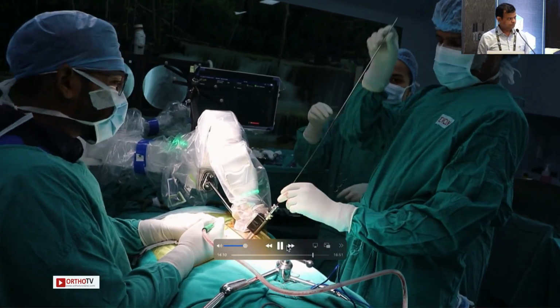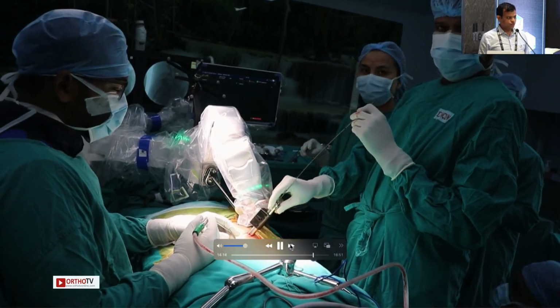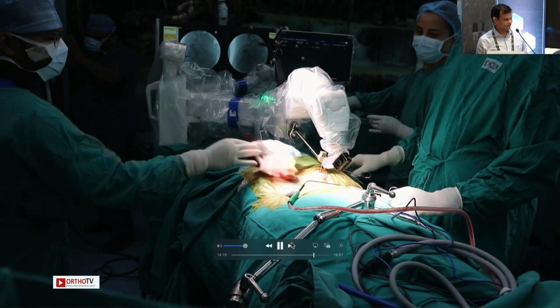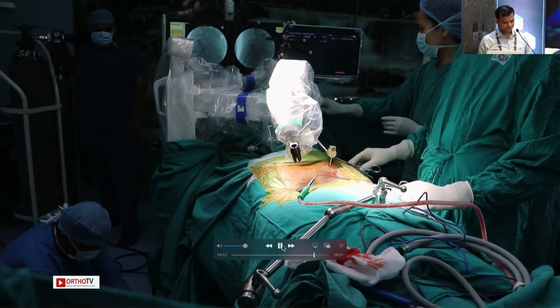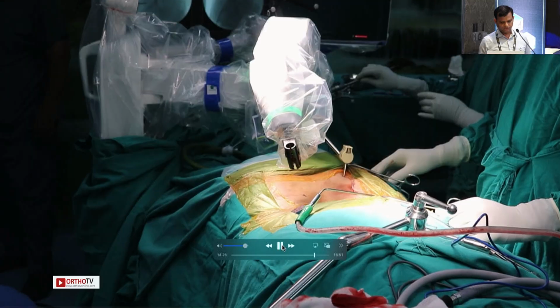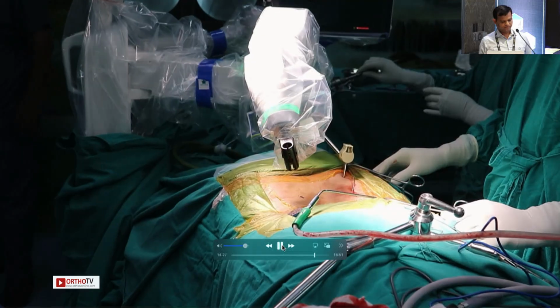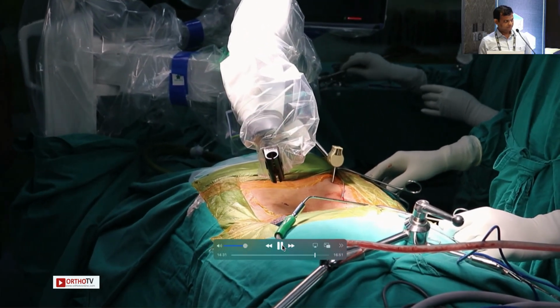But you won't be able to see the screw going in, right? Yes, you cannot navigate the screws. But soon we are going to have all sorts of Indian screws which can be navigable. I think they can make custom screwdrivers for you. But you have to use the Medtronic screws, they don't allow us to use the other screws, because the optical markers are meant for the Medtronic ones only.